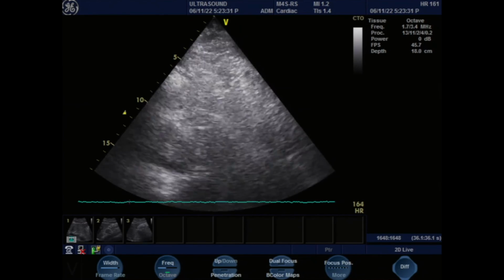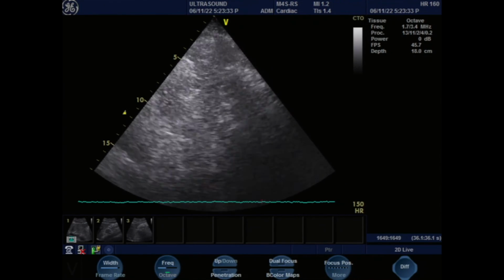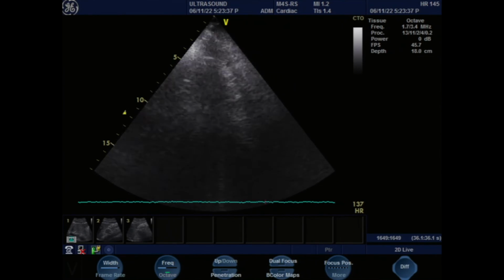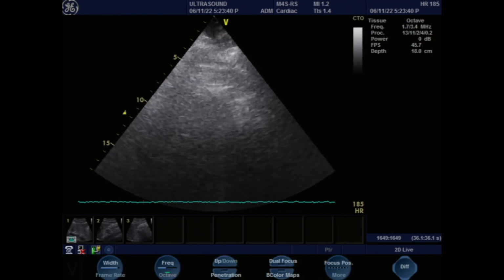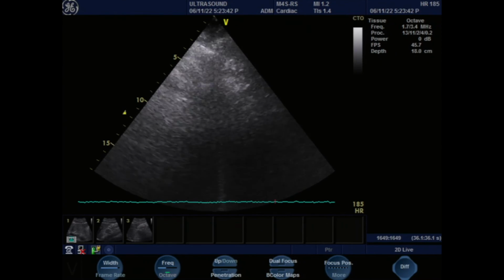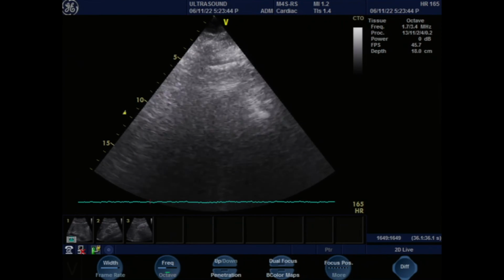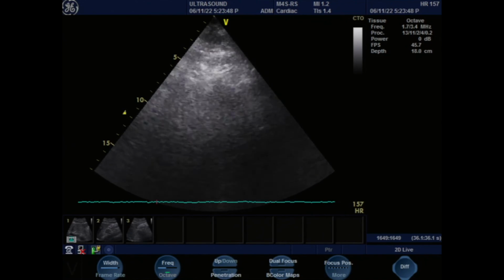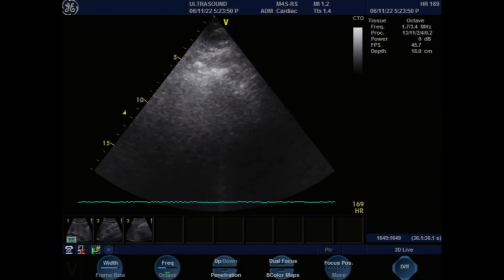We were trying this. So where the heart is visible, you want to be at the plane of the heart, so you turn this way. But I think in him we found that if he turns towards us, that's when we actually get it, remember? So let's see if we can get anything in between without turning.